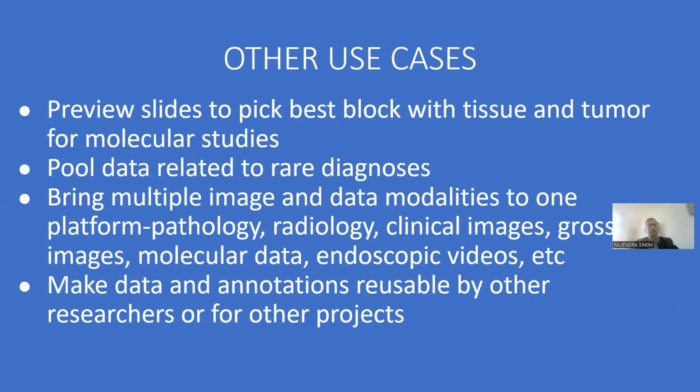It also provides the ability to pool data from multiple repositories, especially when it is related to rare diagnoses like tumors in childhood. The platform allows the ability to bring in radiology images along with the pathology images, any kind of clinical images, endoscopic videos. So it's almost like a single ecosystem for all data that could be brought in for research. And it also has the ability to make the data and the annotations that were created reusable by other researchers or by the same researcher for other projects.